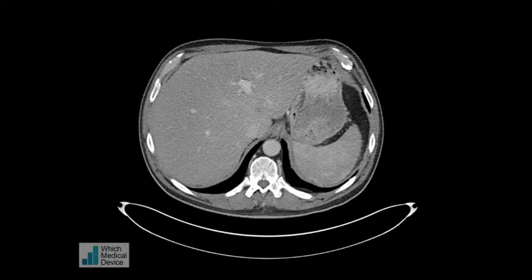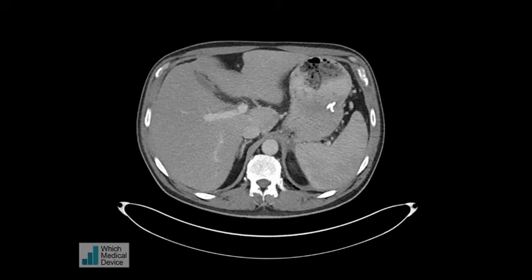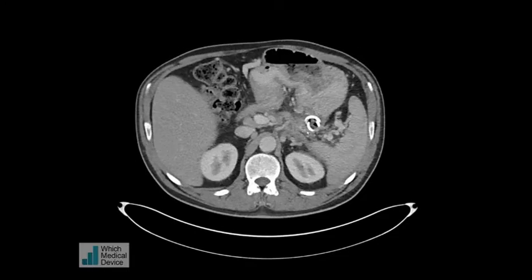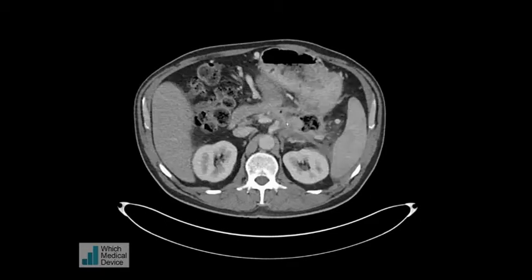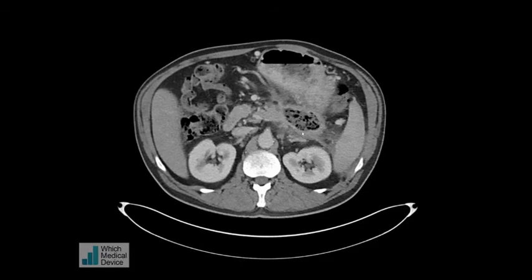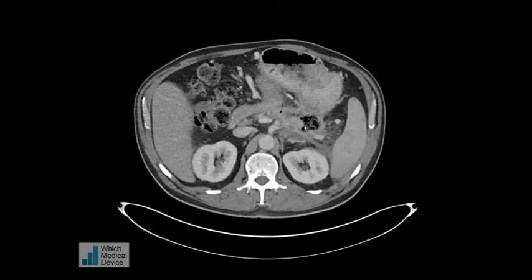This patient has severe pancreatitis and presented with a major upper GI haemorrhage and haematemesis. At this point they are ventilated and on intensive care. This is the post-contrast CT scan, which is not as arterial as we would have liked, but here you can see the cystogastrostomy stent all the way through from the stomach into the collection in the lesser sac. This collection is the pancreatic fluid collection, inflammatory, and is the likely cause of the upper GI bleed, with the haemorrhage possibly arising from the splenic artery which would be going very freely through this stent into the stomach causing haematemesis.